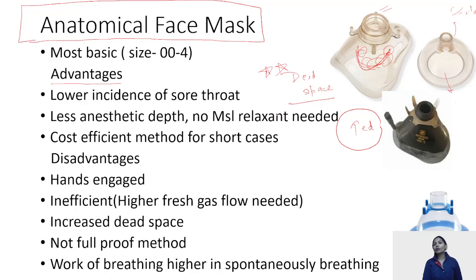The advantages of this mask are, as it does not require any airway manipulation, there are no chances of sore throat. Anesthetic depth has to be less. No muscle relaxation is required if you are putting only this mask over the face of the patient in order to provide him or her with oxygen. It is quite cost efficient because these are reusable in nature.